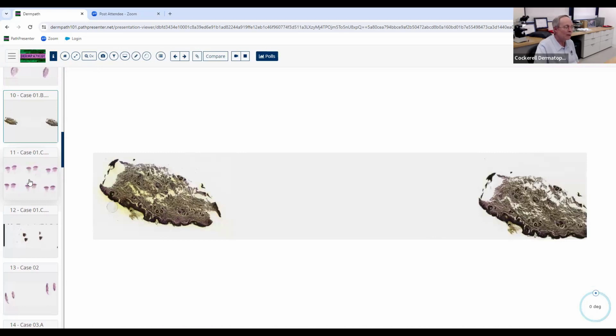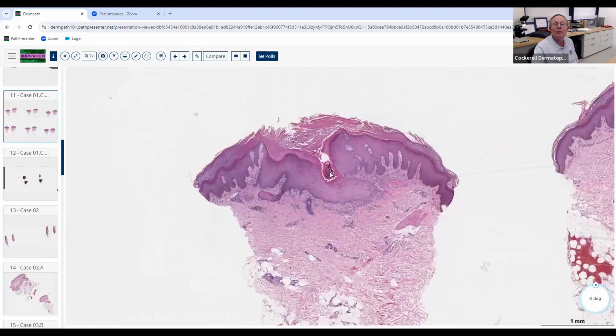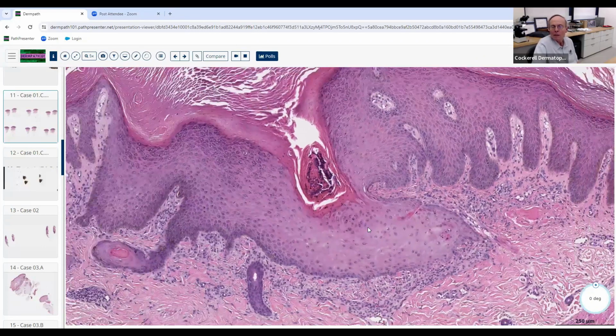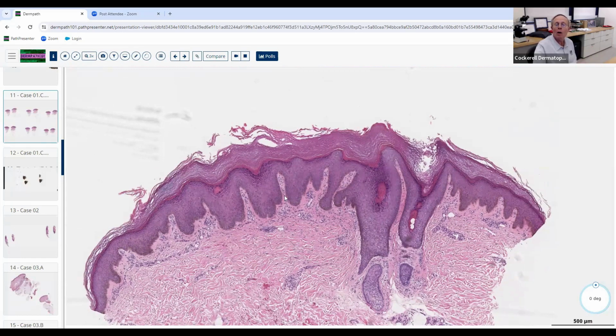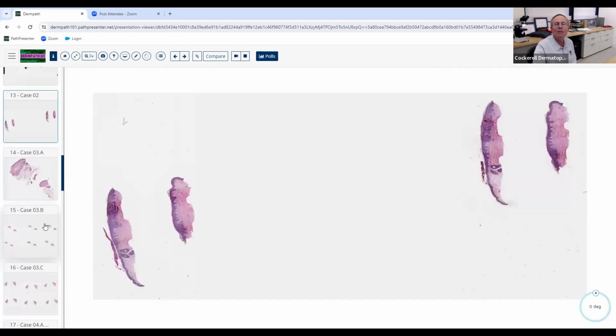I'm not even going to show that one. And here's one last one. So it's the same thing. See how repeatable it is? It looks the same every time. You've got this tunnel that gets formed when patients rub and scratch. If you just have this side, that's prurigo nodularis. There's no perforation over here that you can see. So we're off to the side of it there, and you can see it's got beautiful lichen simplex. So that's basically proof positive that you have to be scratching these things for this to happen.